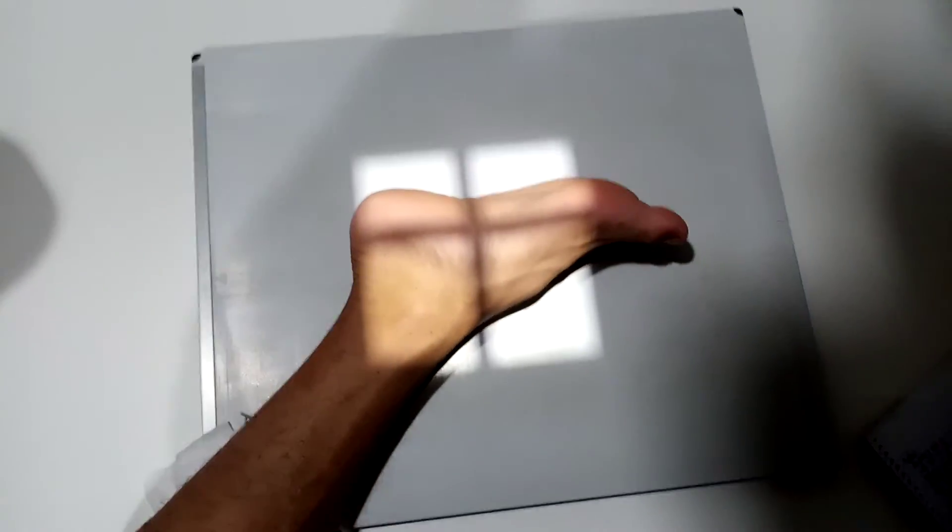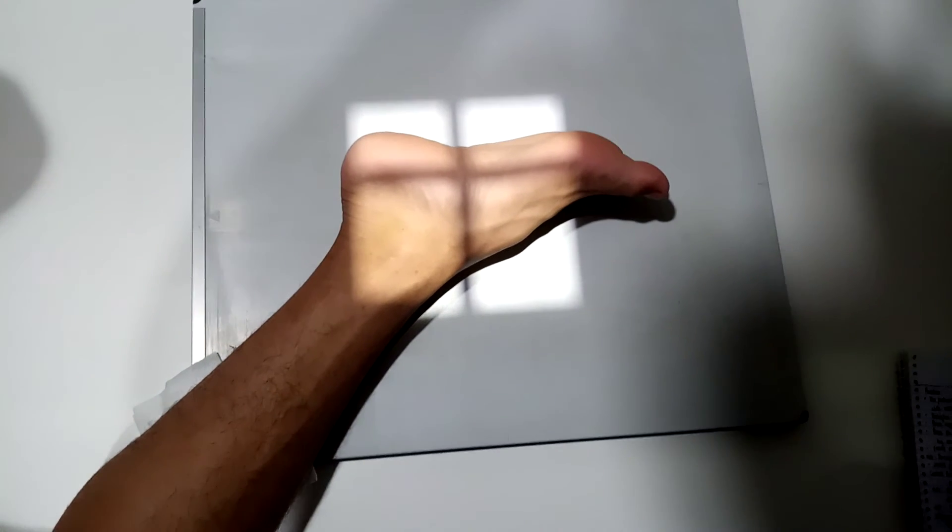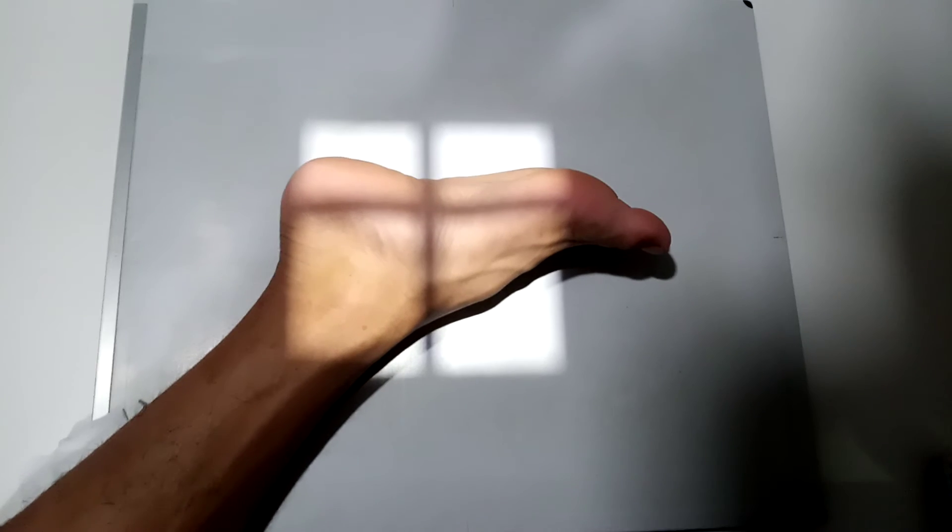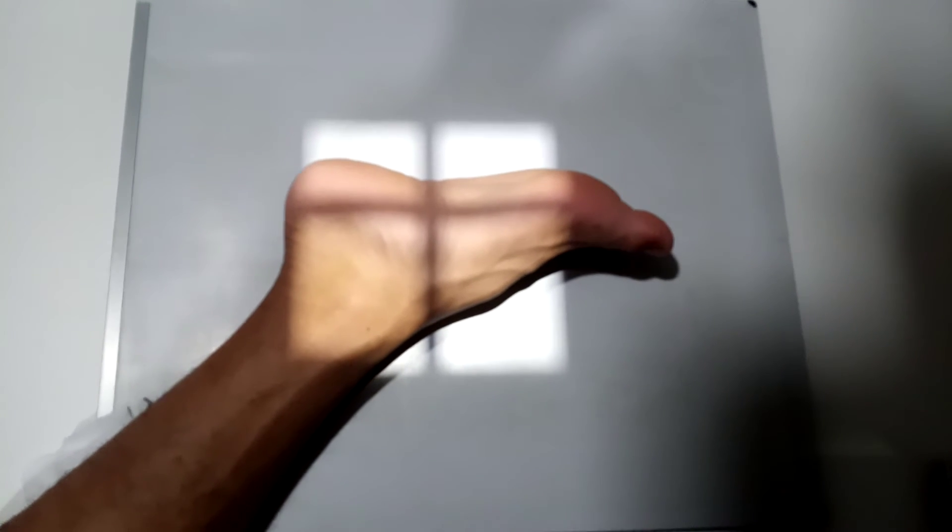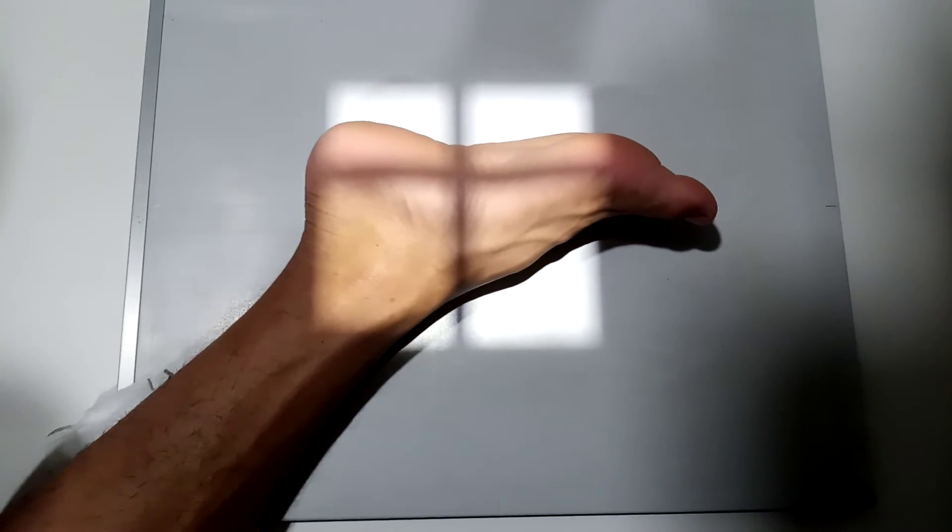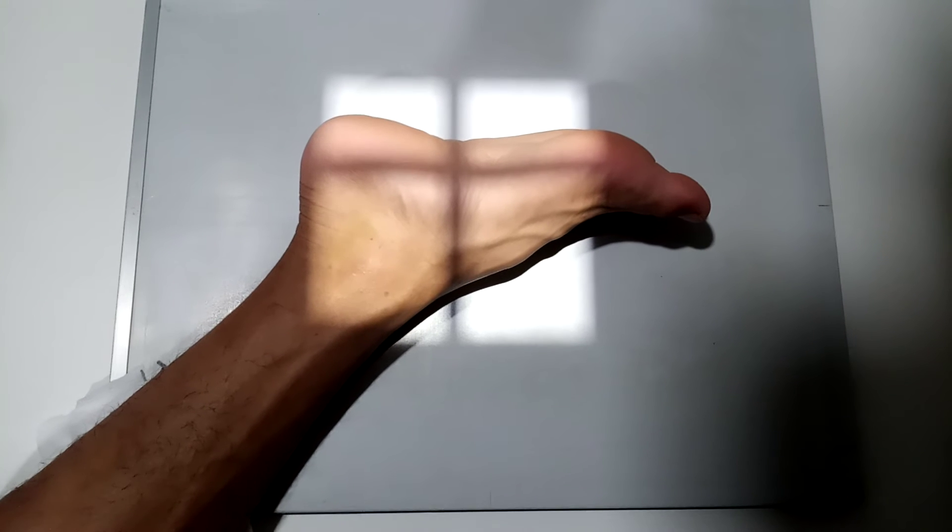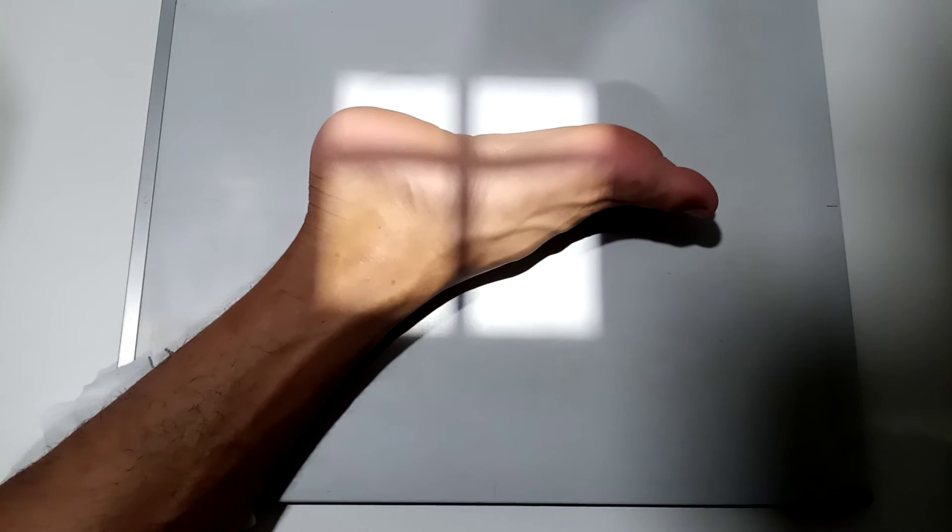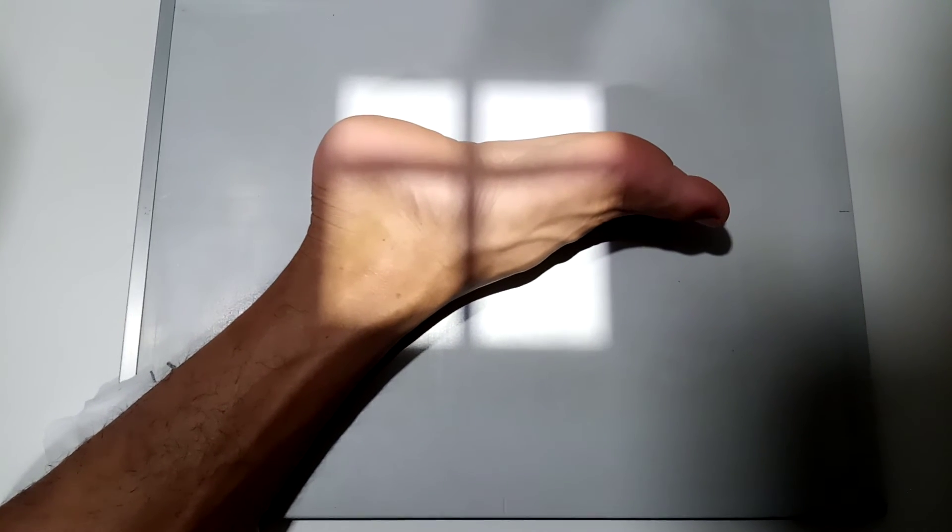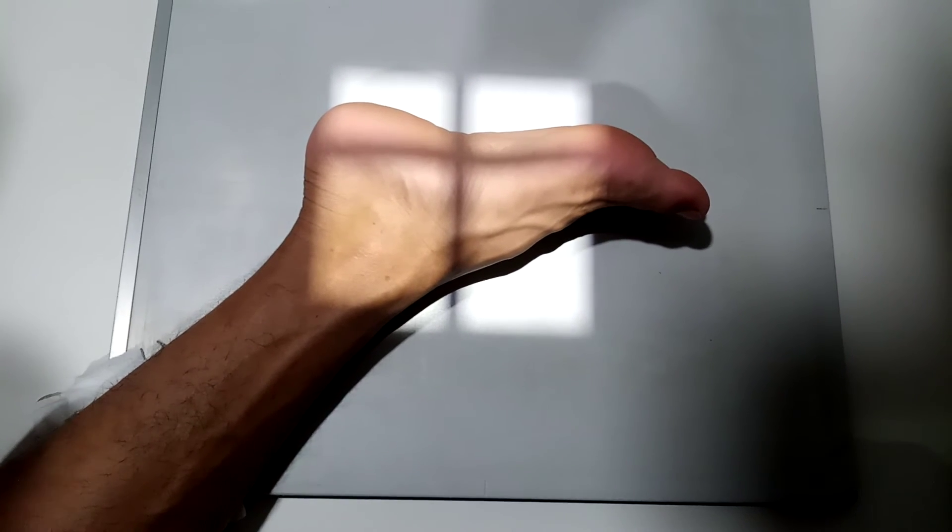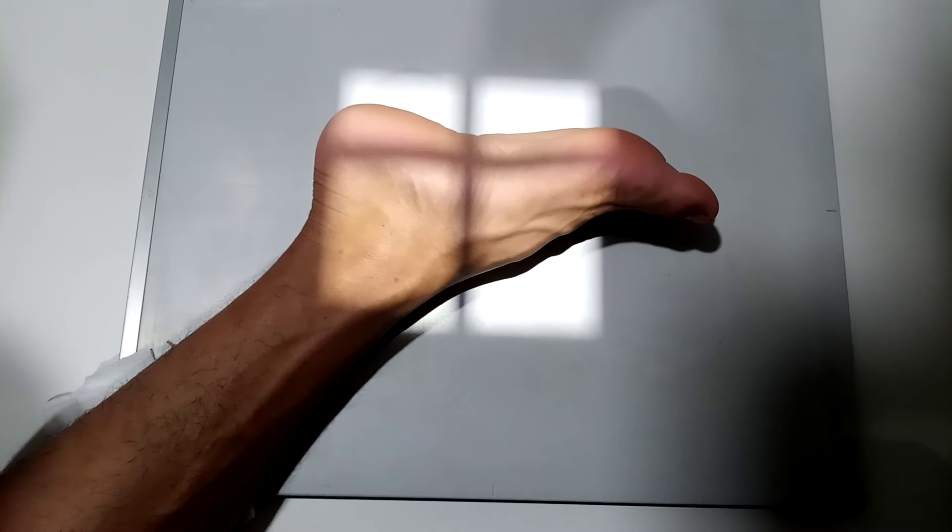Place support under the knee as needed for the lateral foot and ankle of the patient. Place the long axis of the IR parallel with the long axis of the patient leg and center into the ankle joint. Ensure that the lateral surface of the foot is in contact with the IR.